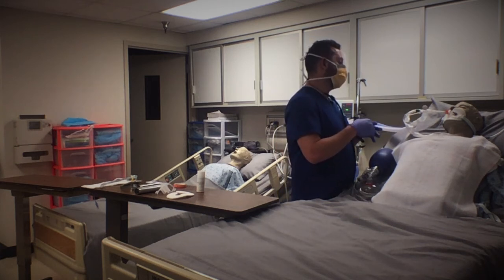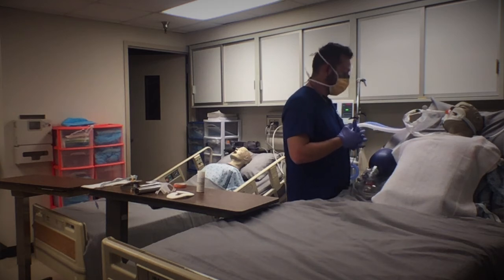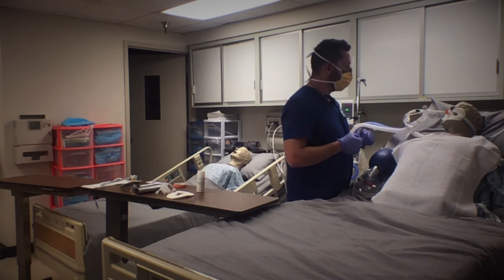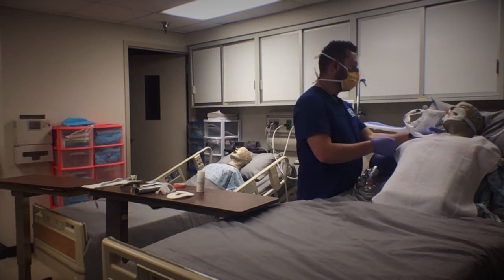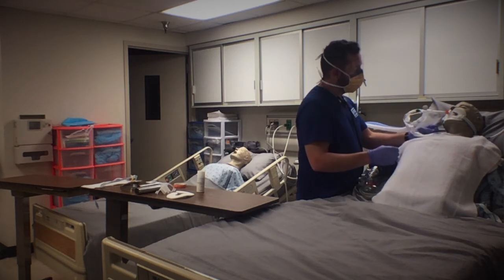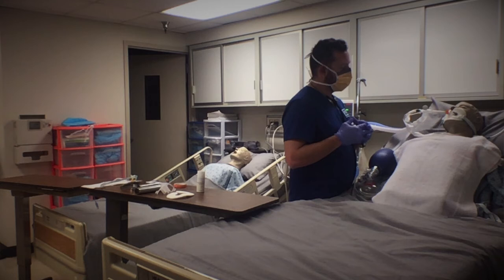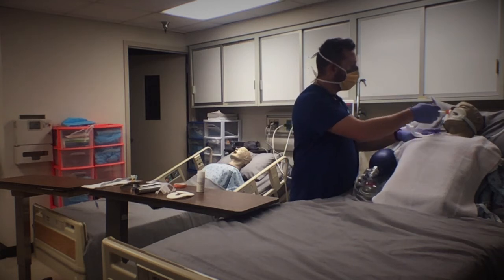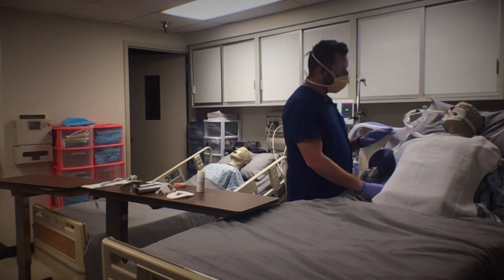So Mr. Daniel, my name's Daniel DeBerry. I'm a student respiratory therapist, and today we're going to get you off this vent and we're going to get that tube out of your mouth. So when we go to do that, I'm going to deflate a cuff that is keeping the tube in place within your airway. When I deflate that cuff, I'm going to need you to give me the biggest cough you can. And I'm going to pull the tube out as you're coughing. I'm going to put it right here. So when you're ready, I'm going to deflate the cuff and pull the tube out.